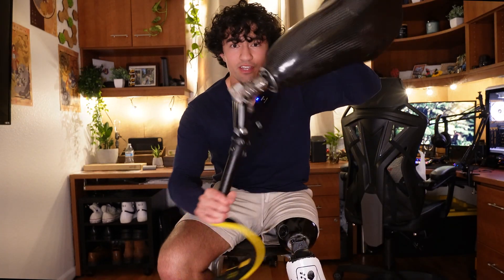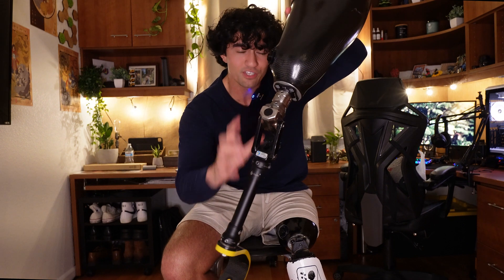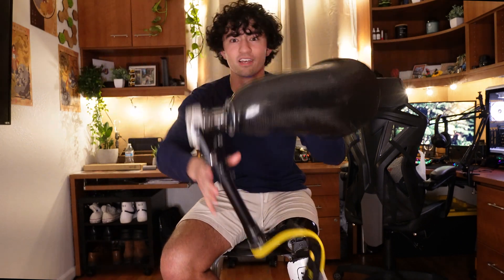Before we begin, there are different prosthetics we have to know about. There is the mechanical knee and there is the microprocessor knee. The mechanical knee has no technology at all — it relies entirely on the mechanics of the actual prosthetic, like the running blade. Every time that knee drops, it's not going to be controlled on the way down. Gravity just does its work.